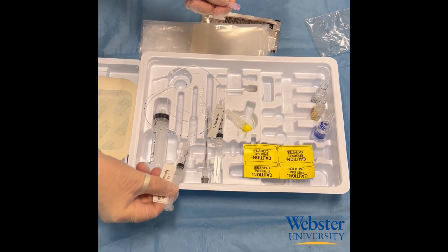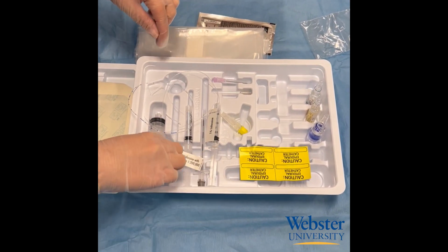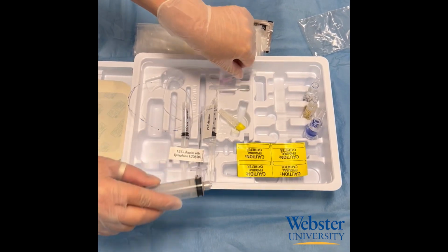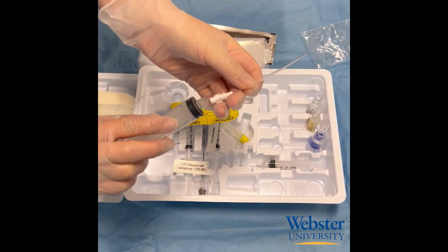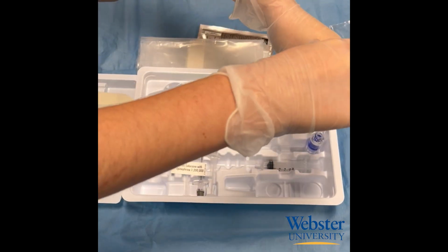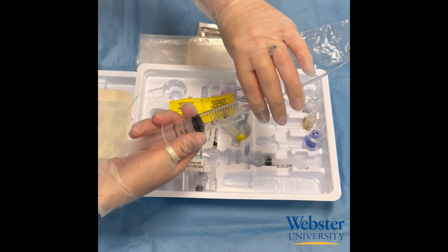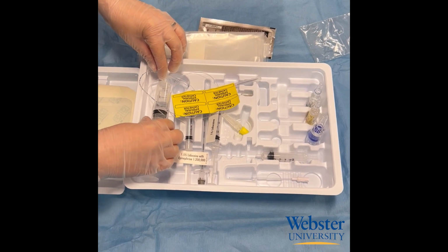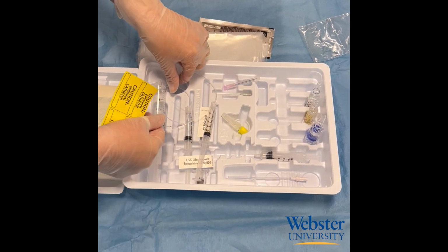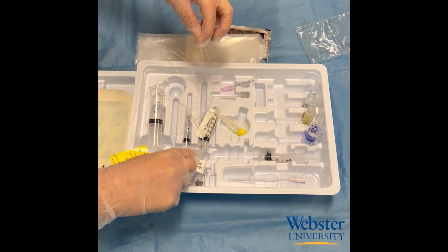Oops, don't throw the syringe off the sterile field. And then saline for the loss of resistance technique. Finally, don't forget to label the epidural catheter to make sure it is never accidentally used as an IV.